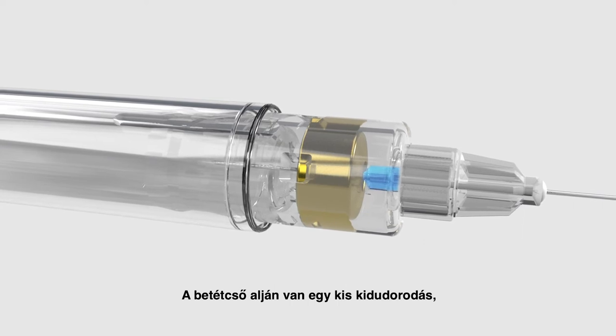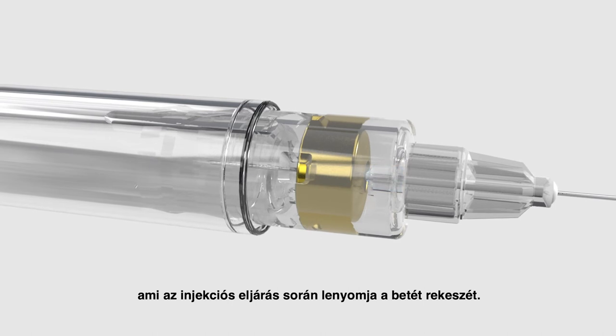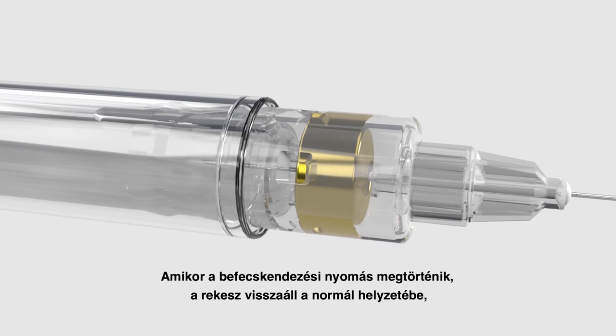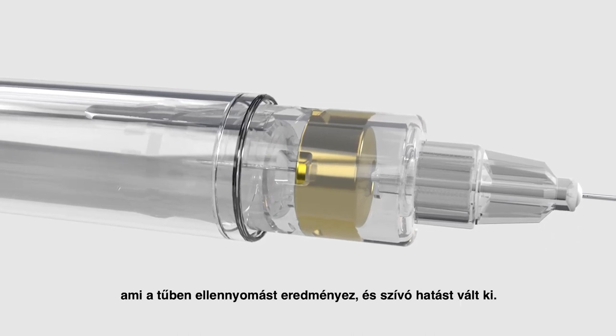There is a small protuberance at the bottom of the cartridge barrel. This depresses the cartridge diaphragm throughout the injection procedure. When injection pressure is released, the diaphragm will return to its normal position, causing back pressure in the needle, resulting in aspiration.